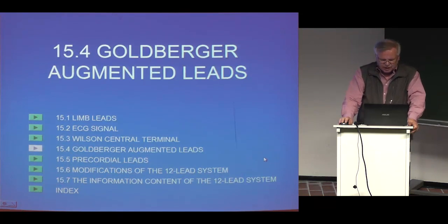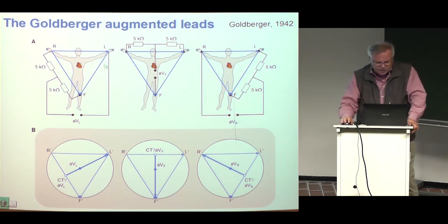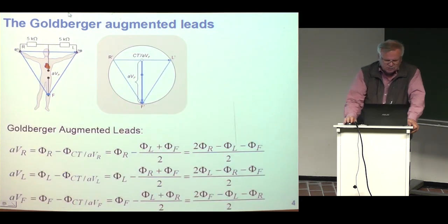Mr. Goldberger, I have not found a photograph of Mr. Goldberger, even though he got himself into the pages of the history of electrocardiology. He found that when recording the Wilson lead VL, we can just omit the 5 kilo-ohm resistance from the central terminal going to the left arm. Similarly in these two other leads, because then in the image space, the reference is moving from the center of the image surface to the middle of the line joining F and R, which means that actually this lead vector, the corresponding lead vector, comes 50% longer. So let's have a look here.